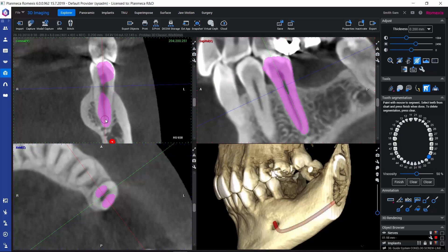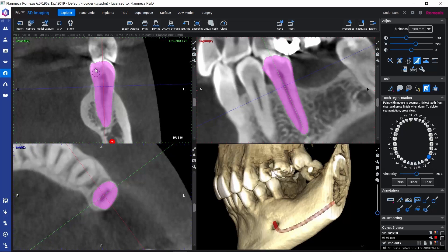It could be good practice to first paint the tooth in the sagittal and coronal views. Everything that is painted will become part of the surface model representing the tooth. If any paint is in the neighboring teeth, we can remove that with the right mouse button — so left mouse button for painting, right for removing the paint.